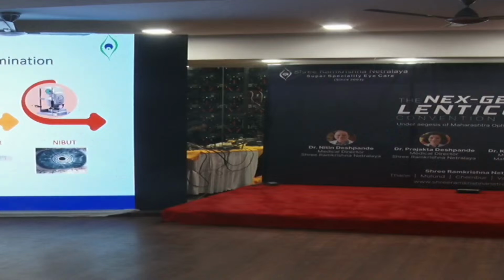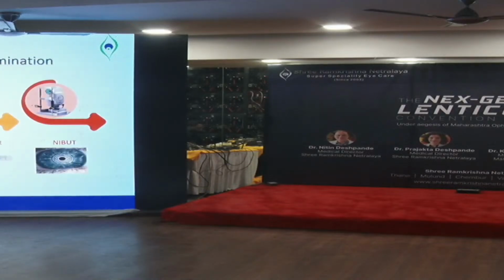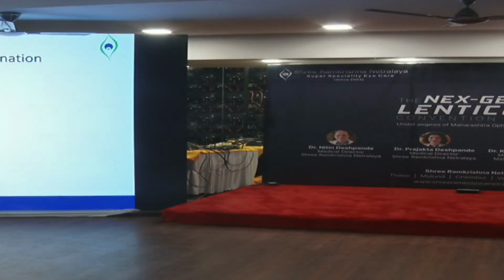Examination of ocular surface is also equally important because it helps us to achieve good outcomes. And at our center, we do tend to perform LipiView, which helps us to assess lipid layer thickness, do Schirmer test basically to rule out presence of any dry eye, and non-invasive breakup time to assess the stability of the tear film. Fundus examination is done extensively to rule out any retinal pathology and to look out for retinal tear, detachment, lattices, and holes.